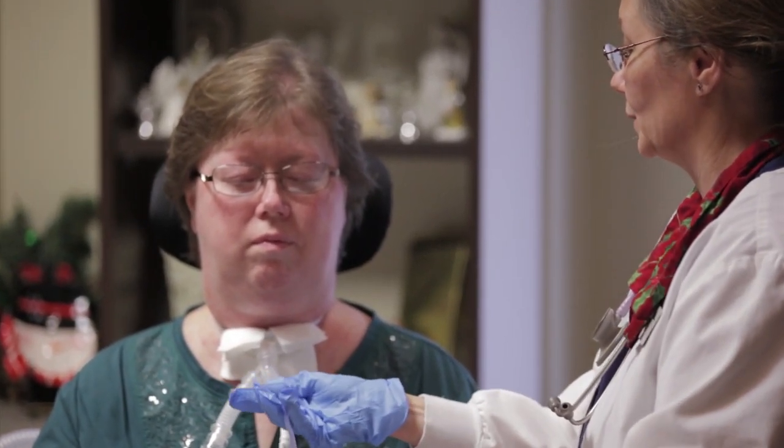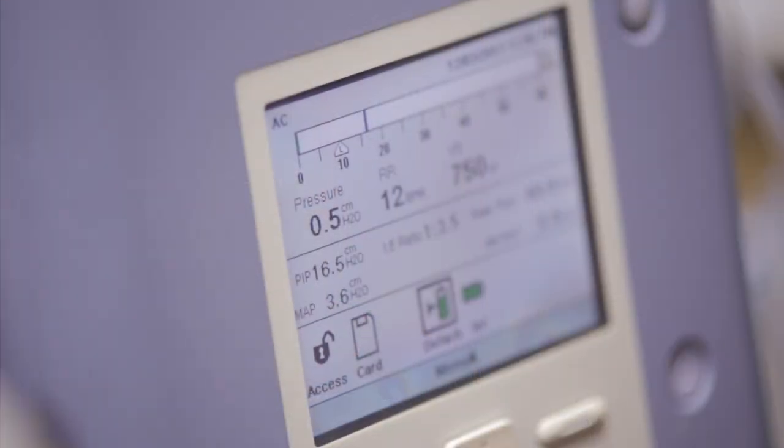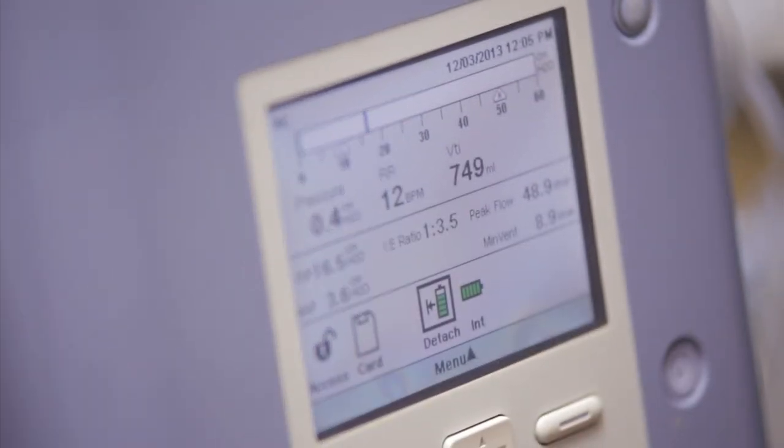Not much there — you did great. Must have been suctioned recently. Linda, your vent settings are a tidal volume of 750 milliliters, which the doctor ordered, and your rate is at 12.